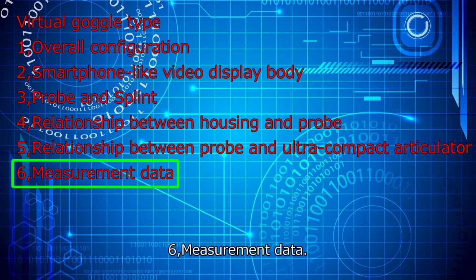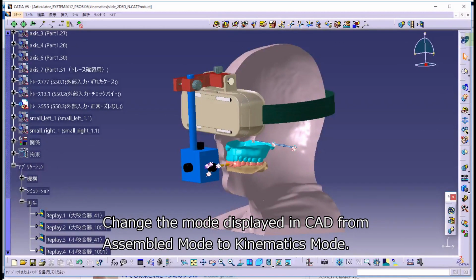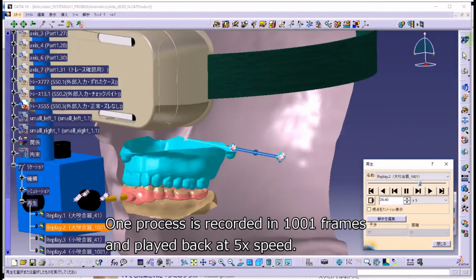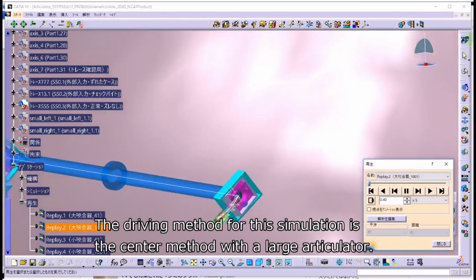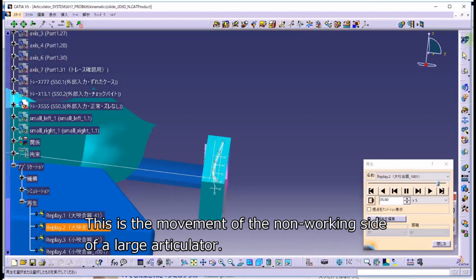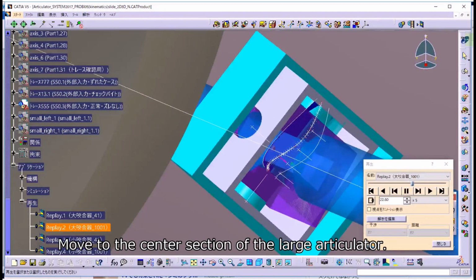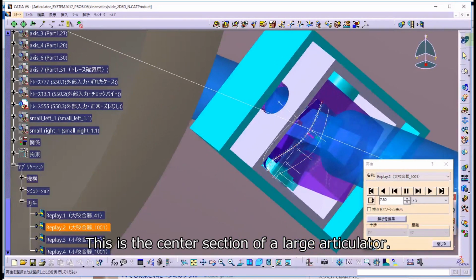6. Measurement data. Change the mode displayed in CAD from assembled mode to kinematics mode. Simulate mandibular motion. One process is recorded in 1001 frames and played back at 5x speed. A reciprocating right lateral movement has begun. The driving method for this simulation is the center method with a large articulator. This is the movement of the non-working side of a large articulator. Move to the center section of the large articulator. This is the center section of a large articulator.